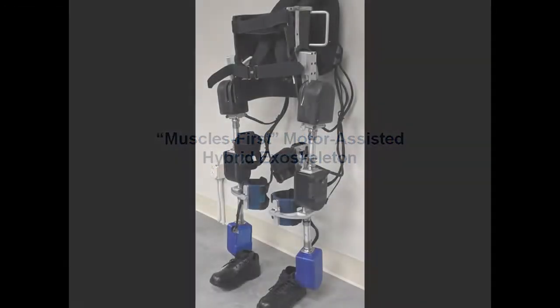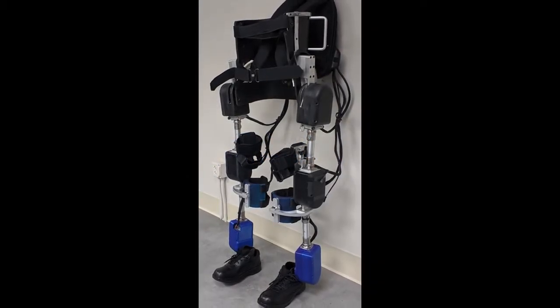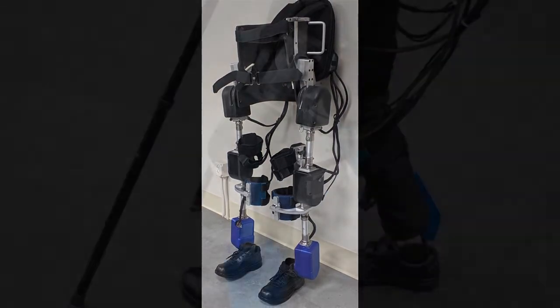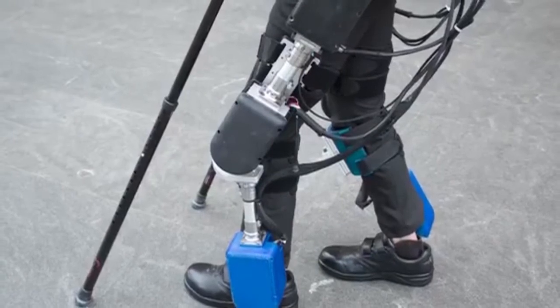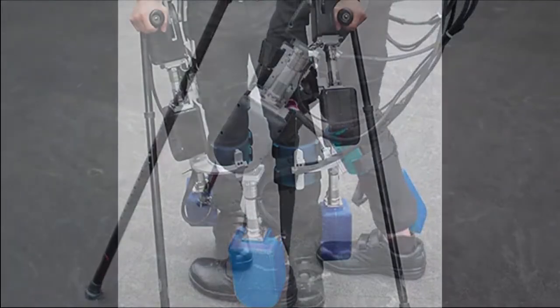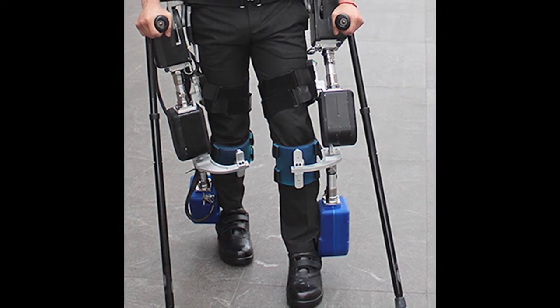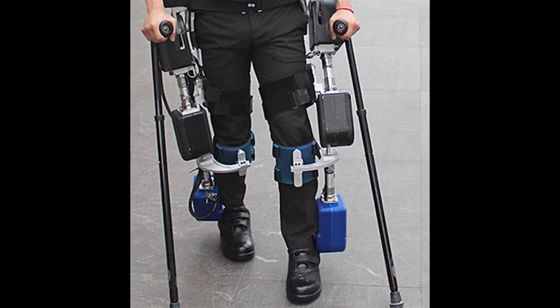The CPWS is equipped with electric motors at the hip, knee, and ankle. Conventional orthotics are used for the trunk and shank, while each joint features its own separate power module with a brushless DC motor, electromagnetic solenoid brake, and harmonic drive transmission. The power units are connected by aluminum tubing with customizable limb length, and pyramid adapters allow for 15 degrees of passive fitment adjustment in the sagittal and coronal planes.